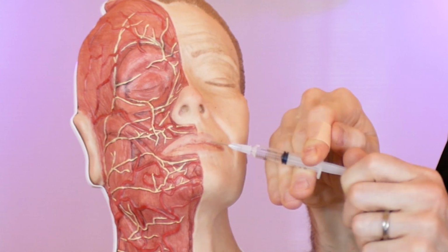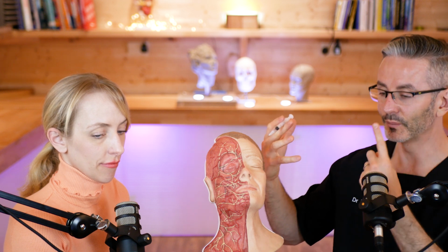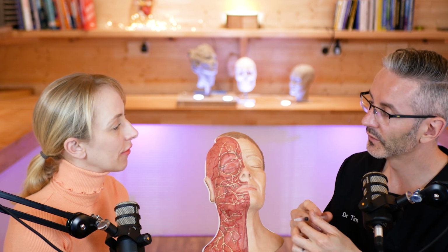I can stabilize. As soon as you don't do that, which is what most new injectors do, you've now got your stabilizing point in the middle of your body. It's really likely you're going to show some imperfections there and move position, and that's really frustrating. So keep it neutral. Will it cause more bruising?